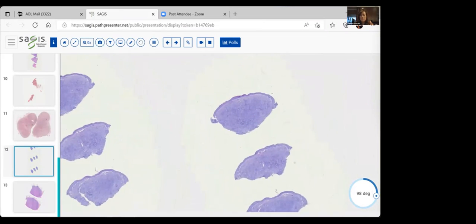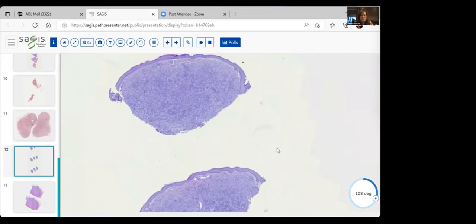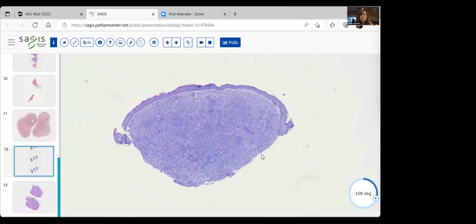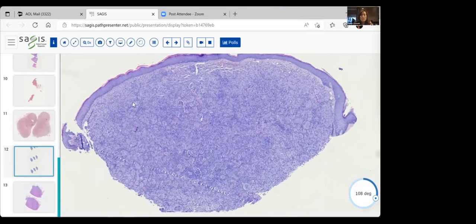Let me go to this top one. I really like this example. It's a little blue, but you still see the characteristic findings of this tumor. The epidermis pretty much fine, is being pushed up, so there's some flattening of the rete here as this tumor is pushing and creating a nodular appearance. And when you look, you see here, there's definitely a lot, maybe sheaths of large cells. You can see them because, again, they're pale, but also background of some darker cells that have less cytoplasm.